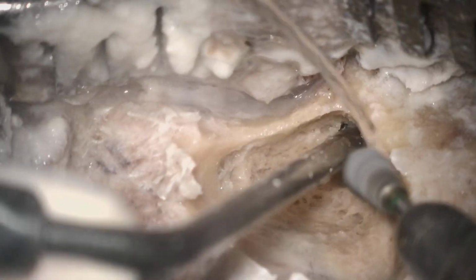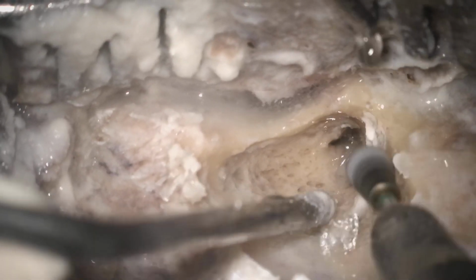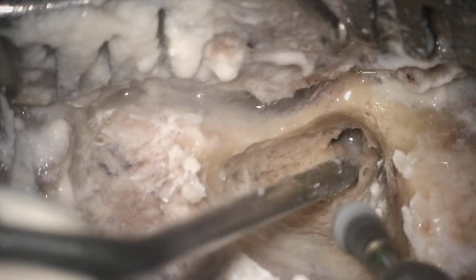So always try to make sure that one side of the bar is in contact. But in these situations, when we are drilling in the tip cell area or in the spine of Henle angle, there will be a chance of some jerky movements. As this is the larger bar, you can change it to a smaller size so that the drilling will be smooth. But for faster drilling, in that part we always use some conical larger bar, and after we have reached our landmark, then we can change to the smaller bar according to the need.